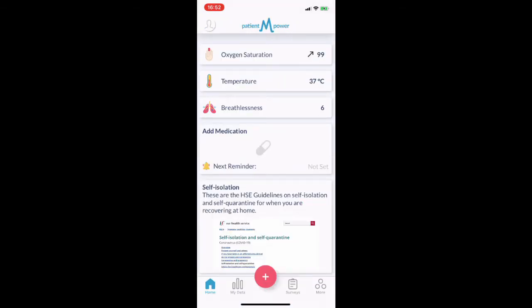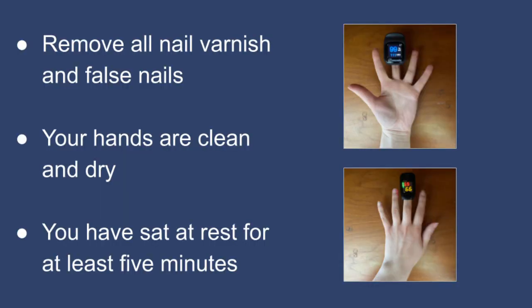If you have a Nonin 3230 device, please pair this to the app before taking a measurement. Once paired, you can take an oxygen saturation measurement. Before taking this measurement, ensure all nail varnish and false nails have been removed, your hands are clean and dry, and you have sat at rest for at least five minutes.